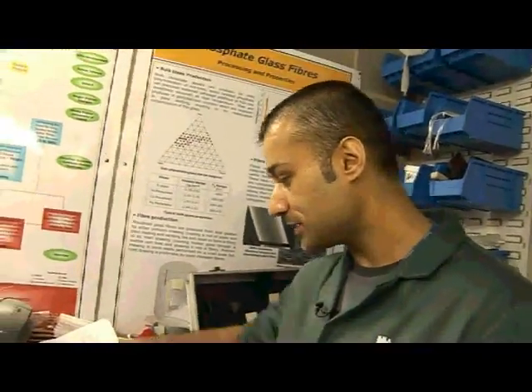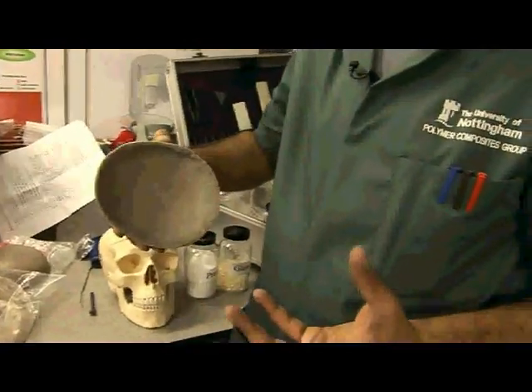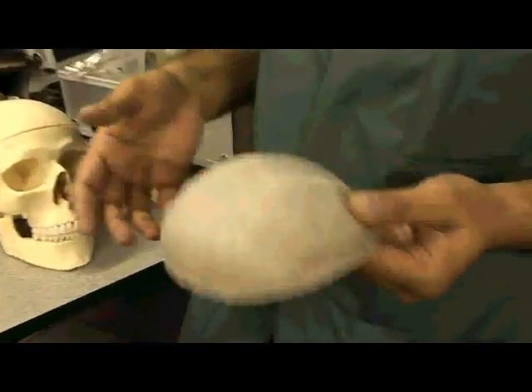In addition to that, we wanted to show, using Henry's skull here, how pliable, formable, and malleable the material is in theatre. Because ideally, if the surgeon can have an added property to it where he can take it into theatre and actually mould the material to fit the actual patient application, that's a huge advantage.